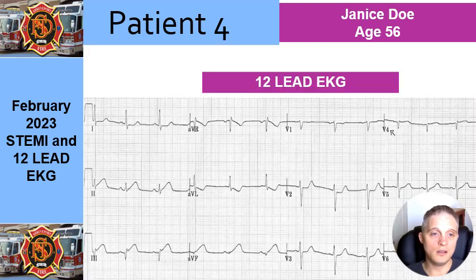And here we see the 12 lead. Man, we look at our 12 lead again. We don't really have a rhythm strip over here, but for general purposes, it looks like a normal sinus, maybe a little bradycardic. But now we go to our ST elevations: 2, 3, AVF, 1, AVL, V5 and V6, and V1 through V4. And this is a V4R, it indicates right there. You'll see right here we have the isoelectric line, but man, ST elevation in lead 3, and then we have ST depression in lead 1.